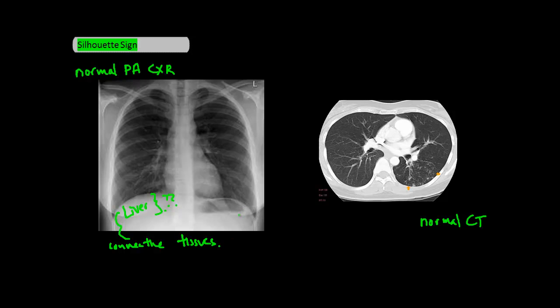Contrast this with what's underneath the left diaphragm. Here we can clearly see the border between the stomach and left diaphragm, and that's because the air found in the stomach is of a different density than the diaphragm, which allows us to see a border between the two.